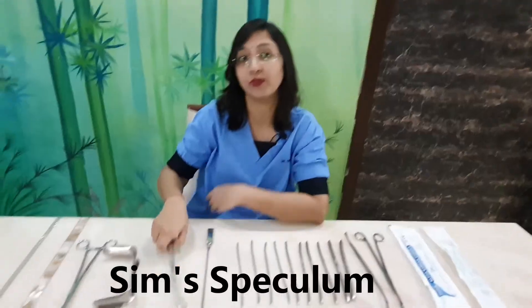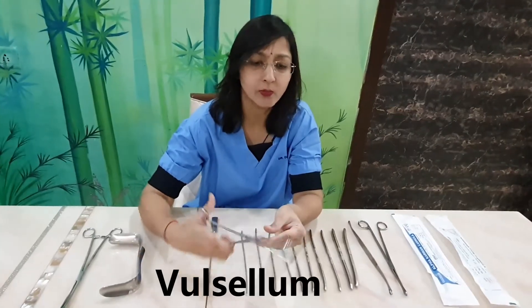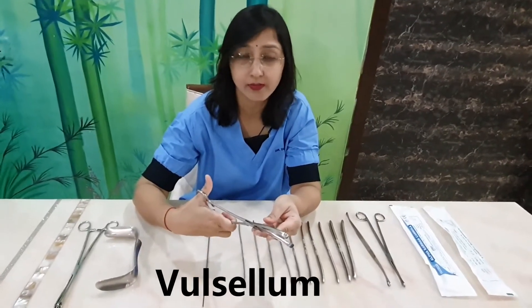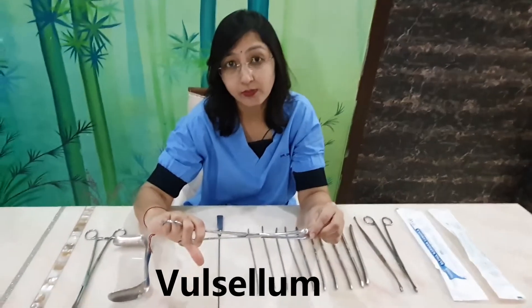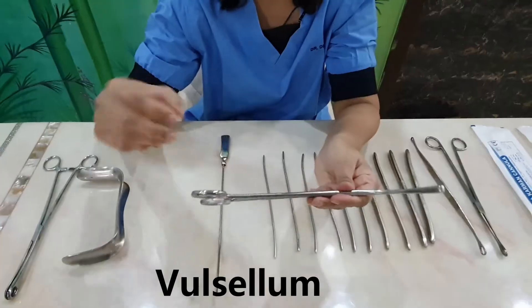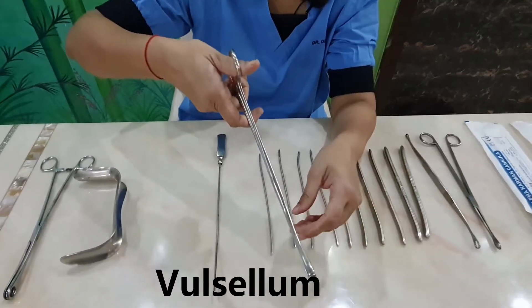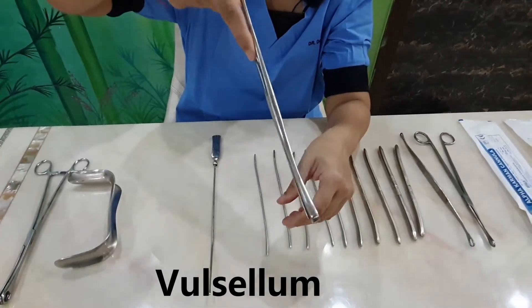This is a multi-tooth valsellum. Single-tooth valsellum is also available, but we usually use the multi-tooth one. You can see there are multiple teeth on it. The multi-tooth valsellum is used to hold the anterior lip of the cervix — with the help of these teeth we hold the anterior lip and retract it upwards.